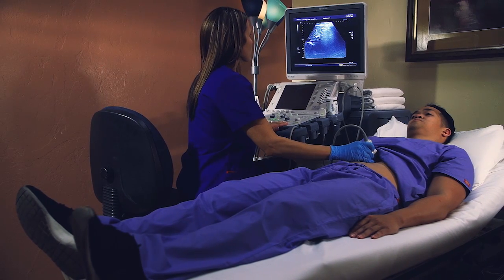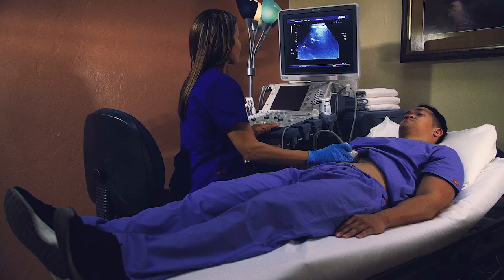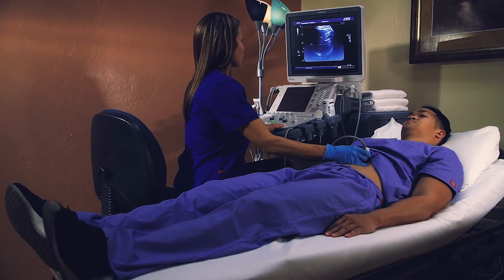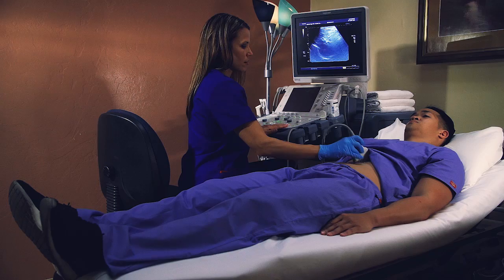Preparations for your ultrasound exam can vary depending on the body part you are having scanned. There is no preparation if you are having an ultrasound of your breast, extremity, or other body parts.